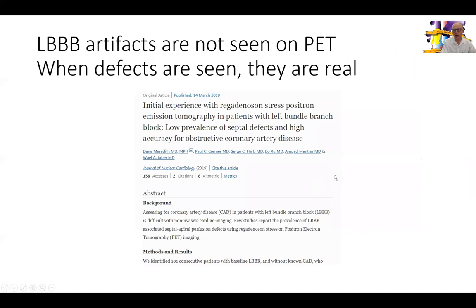This is not just theory — this is a paper we published last year on over 100 patients at our center who were sent with left bundle branch block for PET. We did not observe any instance where PET showed the left bundle branch block–related artifact that is common with SPECT. In cases where we did see defects on PET in the presence of left bundle branch block, those defects almost always resulted from true severe obstructive coronary disease. The specificity of PET findings in patients with left bundle branch block is extremely high. We have now switched our practice — patients with left bundle branch block undergoing pharmacological stress testing are almost always referred for PET.